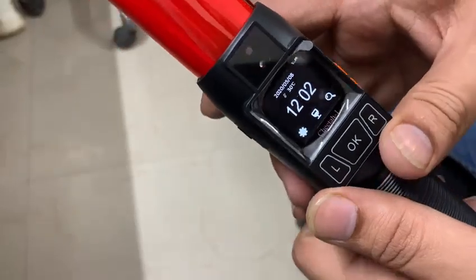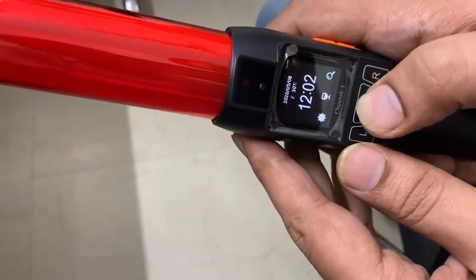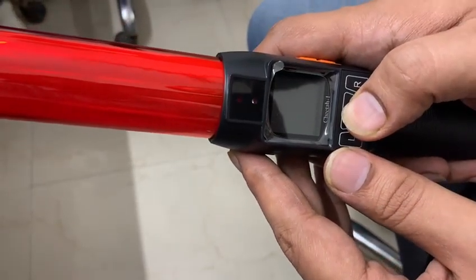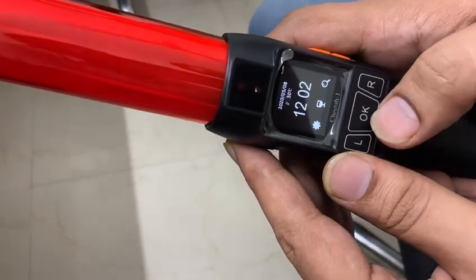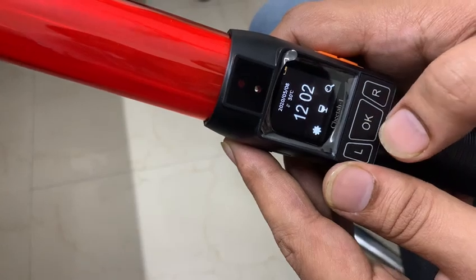If you want to use this alcohol tester, you have to press the OK button — not for a long time, only for a short time.